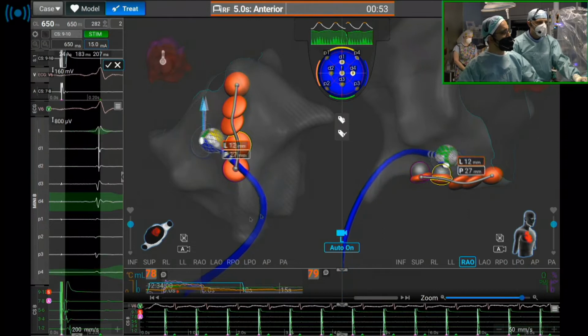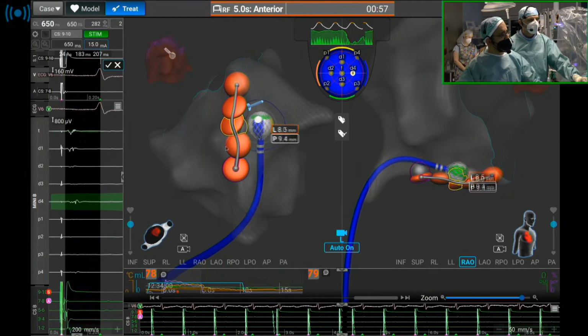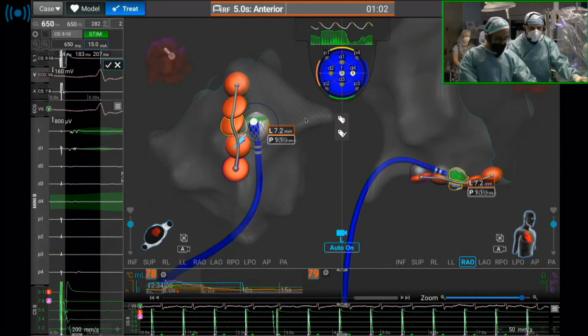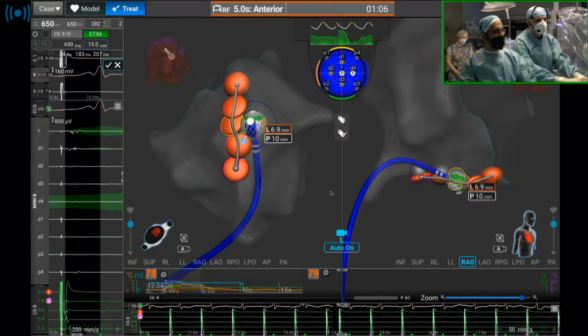Now I'm going to move to the septal aspect, and you see that the vector changes its position going to the line. So there is block across this line. I think, Joseph, that concludes what we have to show you.